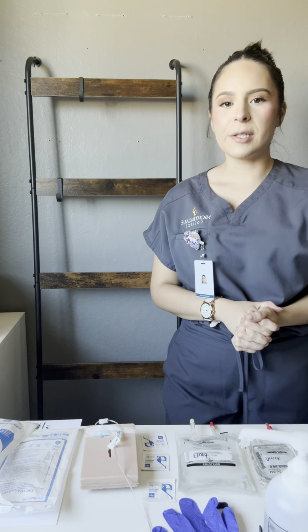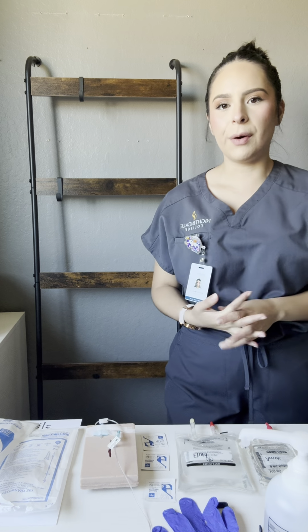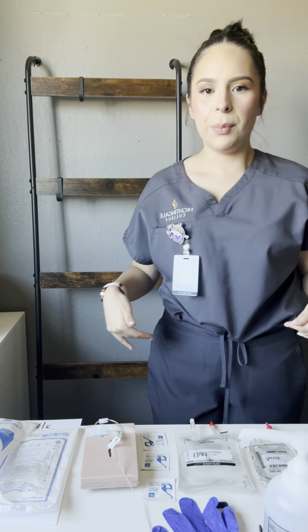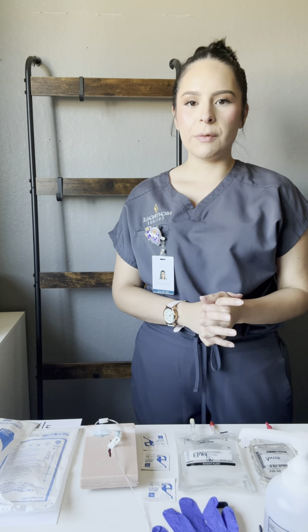Hello, my name is Elizabeth Renteria, and today I'll be performing the skills video for IV fluid and medication administration. I'm in my appropriate Nightingale uniform with my Nightingale badge. Our patient for today will be receiving IV fluids and a piggyback for amoxicillin.